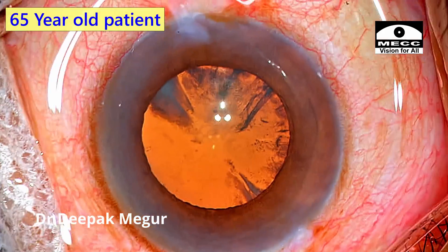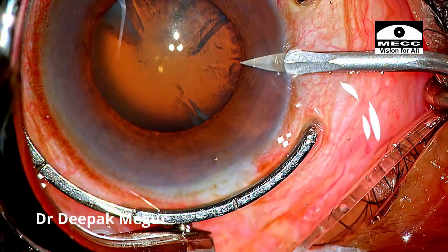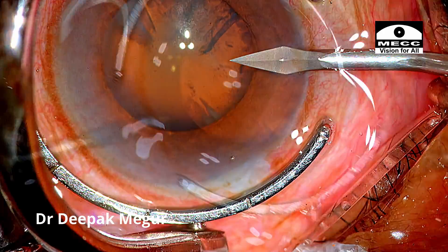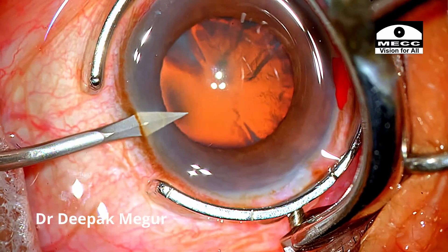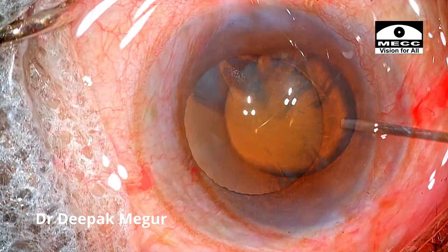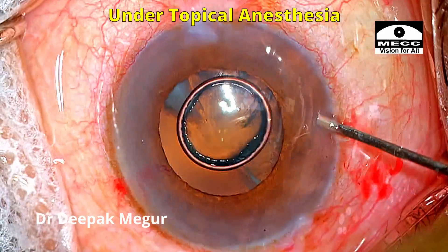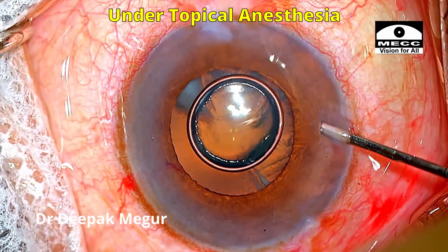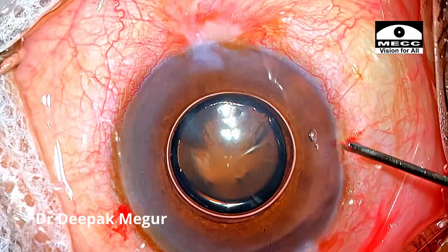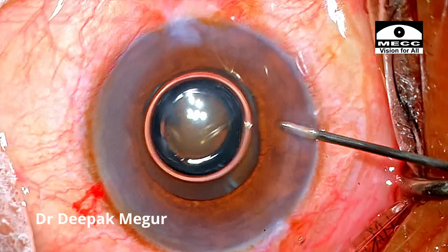This is a 65-year-old gentleman with an innocuous-looking cortical cataract. I begin my surgery making my two side port incisions. The surgery is being done under topical anesthesia, so I'm using intracameral anesthesia. First the air goes in, then the intracameral anesthetic goes in.